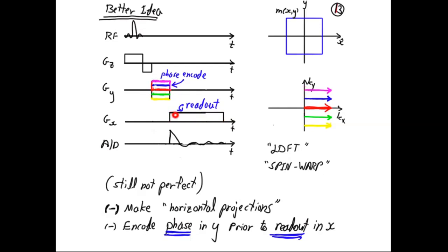And then I'm going to apply what's called a readout, which will then collect the data. So I will collect the data during this time. And then I wait till everything relaxes, and then I apply a blue gradient, like a blue size gradient here, so a smaller one, that will travel up to here, and then I collect a line.